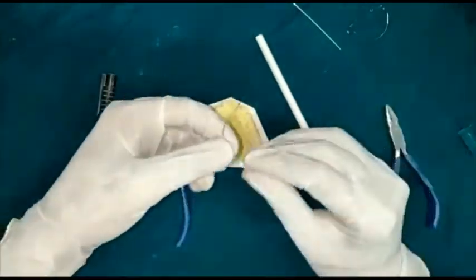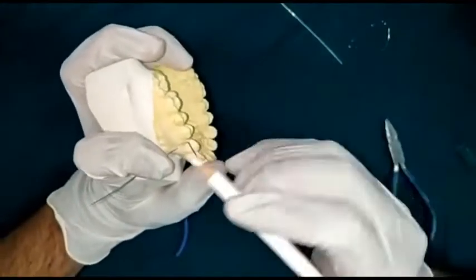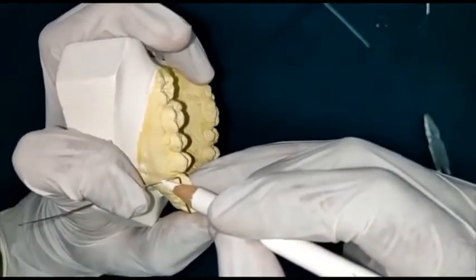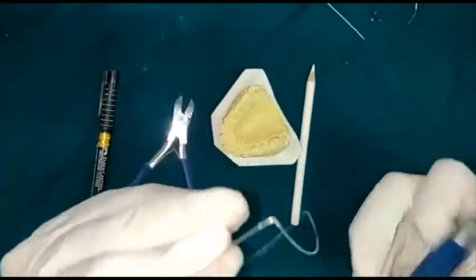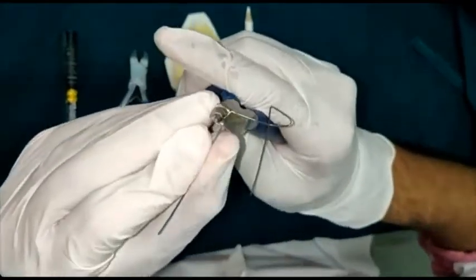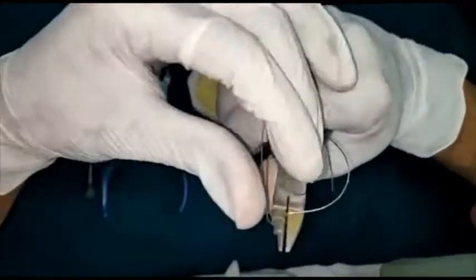At this stage, placement of the wire is a little difficult. Arbitrarily, when you place the wire on the mesial surface of the premolar, your U-loop should lie 1.5 to 2 mm below the marginal gingiva. Take the markings for that on both sides. Then, with the help of a universal plier at the marked portion, you will give a U or round bend.